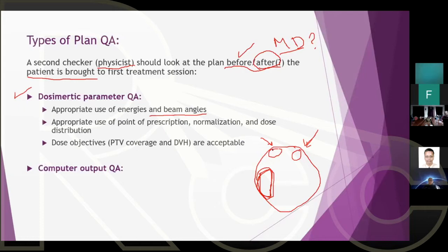Actually, it should have been caught by the dosimetrist and the radiation oncologist, but it wasn't, because mostly they're looking at the high doses, the 100%, 90%, 80%, and any hotspots. And when I looked carefully at what could cause the right eye to have a higher dose, the tumor was fairly far away from the right eye. One of the beams had an entry through the eye.